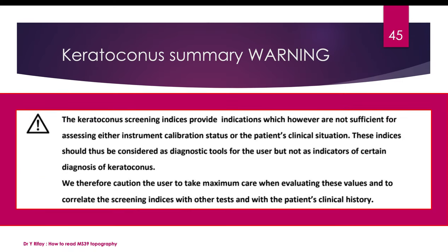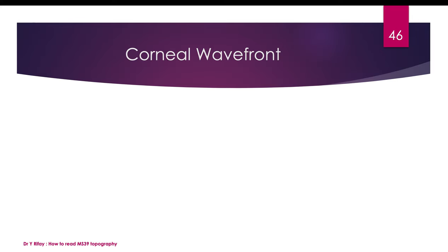But the manufacturer said that these indices or this artificial intelligence will help us. It's a tool to help us. It is an indicator of diagnosis. But the doctor should not follow only these indices, but should examine all the maps and the clinical context of the patient to make the diagnosis of normal or pathologic cornea.